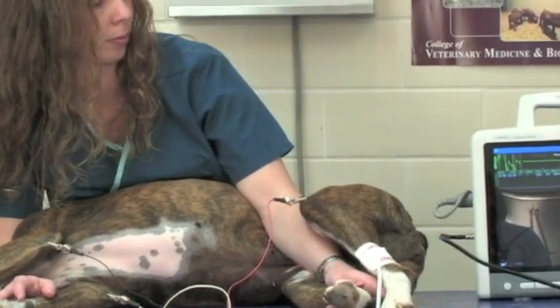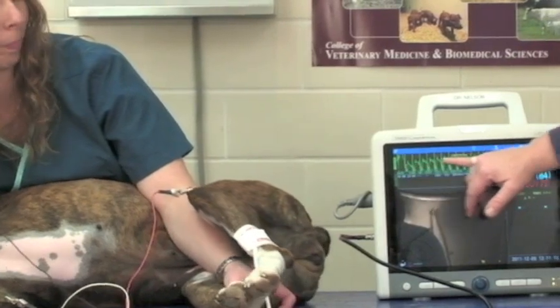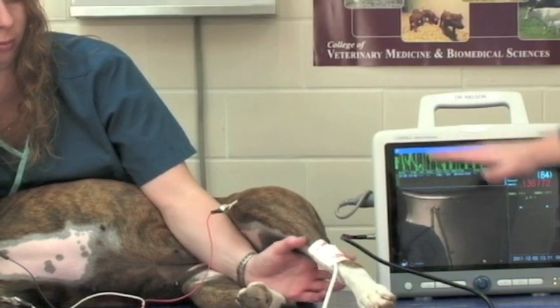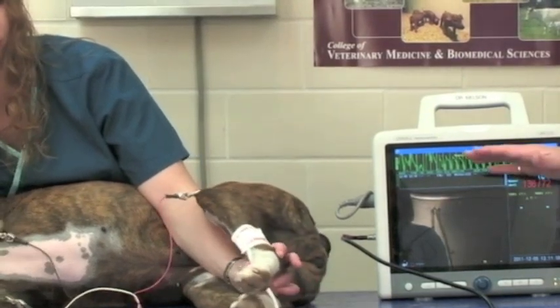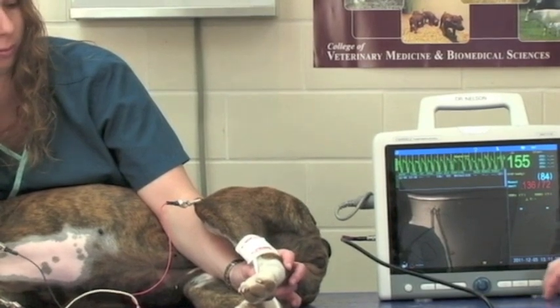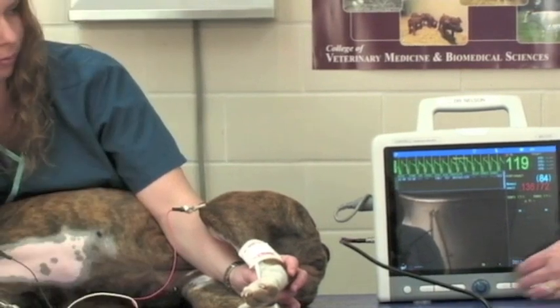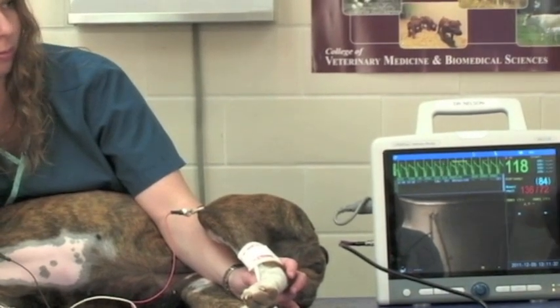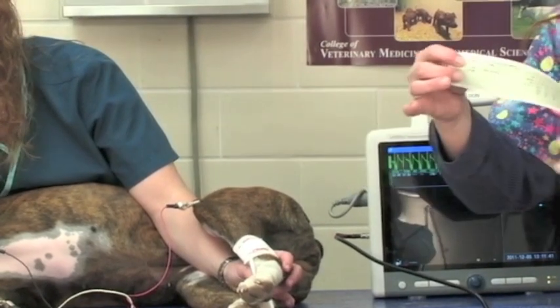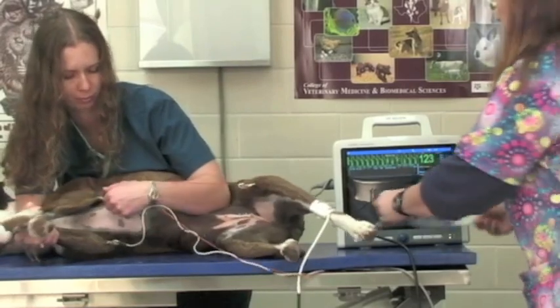And you'll notice we've already gotten one blood pressure, okay? And you noticed up here is our ECG. Now the more our patient moves, it can skew our ECG. So we want to make sure our patient is very still for our ECG. And then I can actually print a strip of that. And we'll normally do about a 2-foot strip of ECG for our patient so that we have a lengthy reading that we can actually look at to make sure that there's no underlying heart problems.